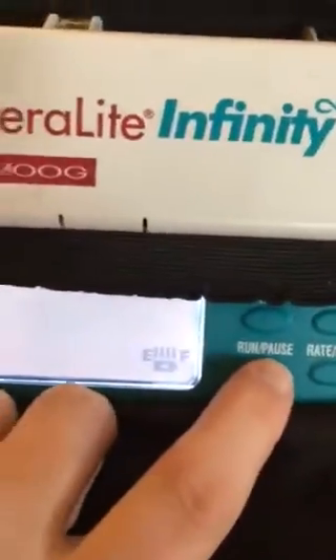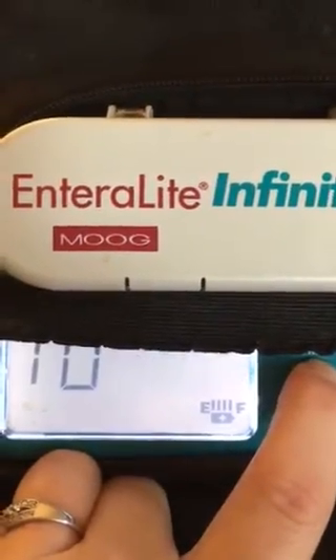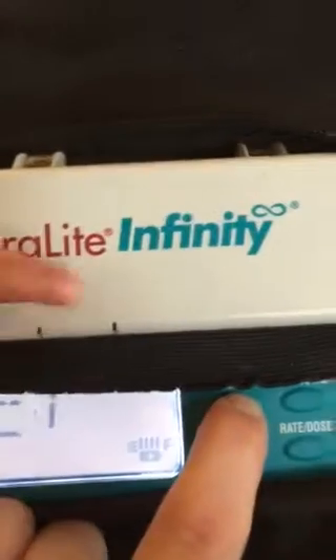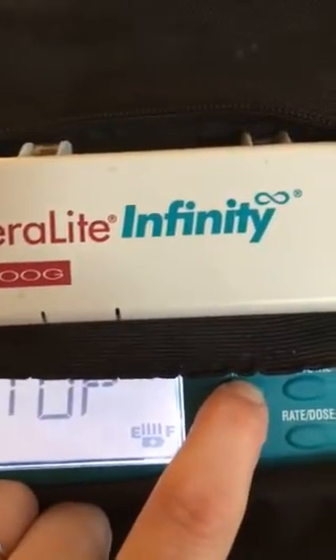Then what I do is I put it back in the machine like this. Hold it there, push pause, push prime.